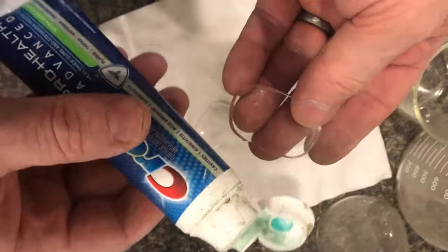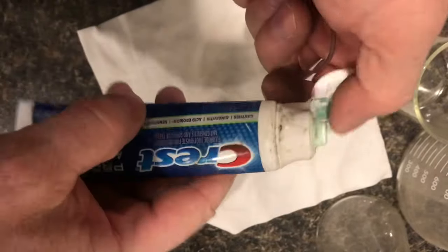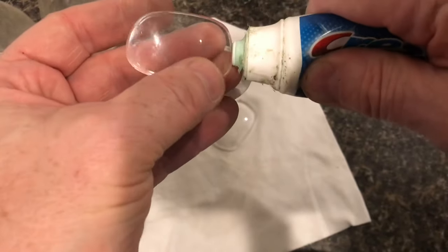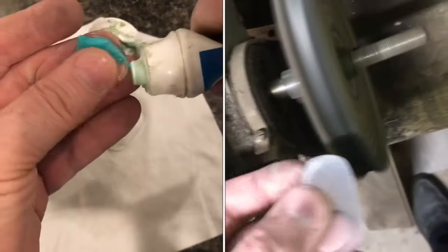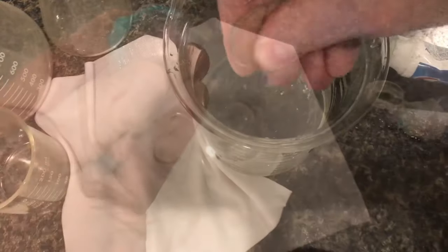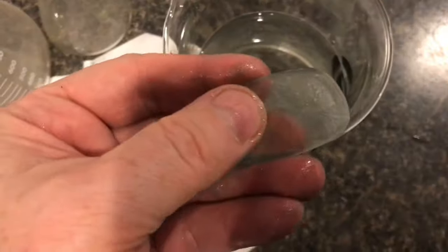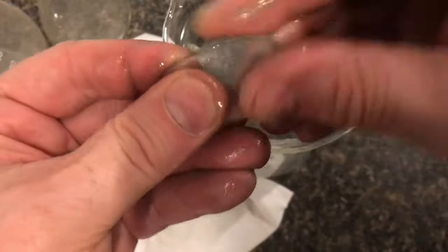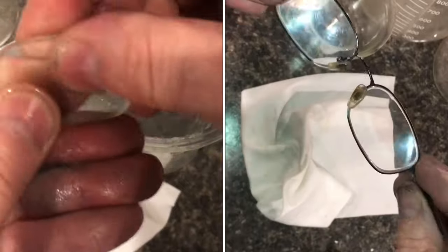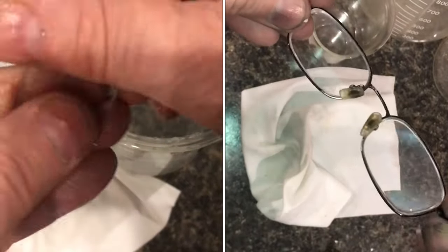I'm going to remove these small scratches with toothpaste. There are real small abrasives in this. This could leave a little bit of haze that's hard to get off unless you have a power buffer. You can feel the abrasives in here. Keep everything wet with a little bit of water. Work the entire lens equally, even on the edges. We'll only polish one lens so you can see the difference.